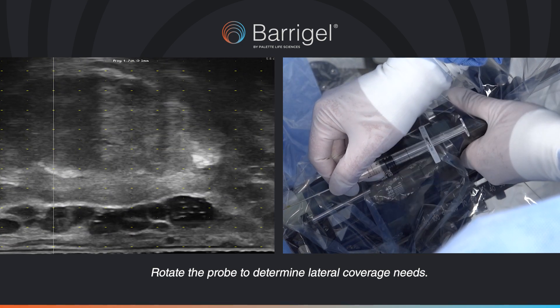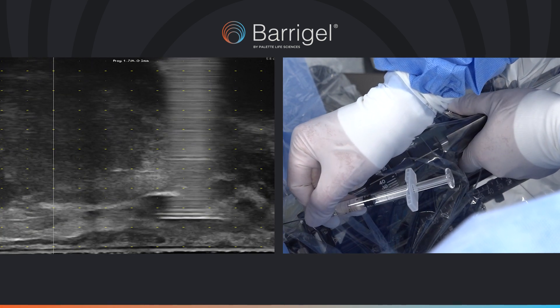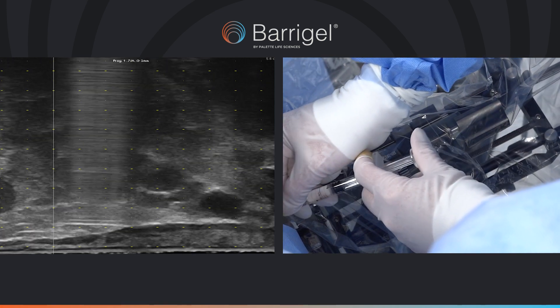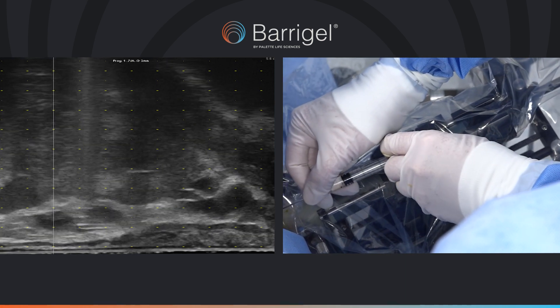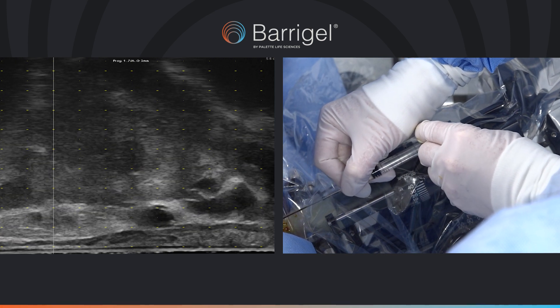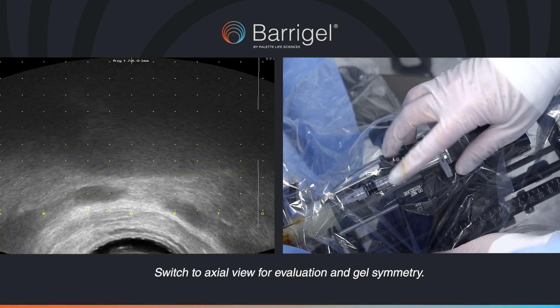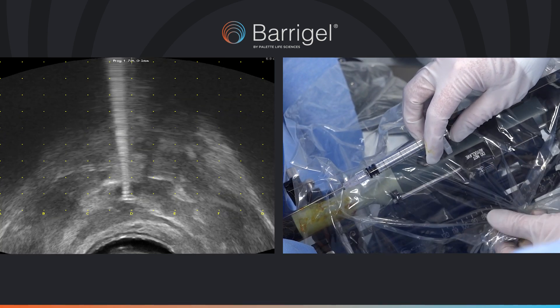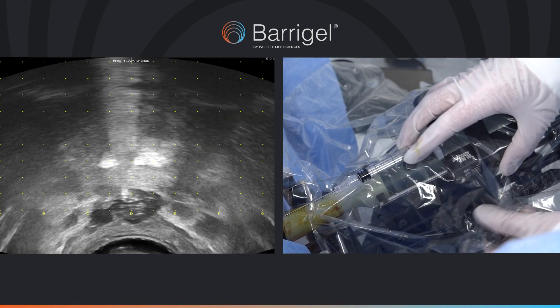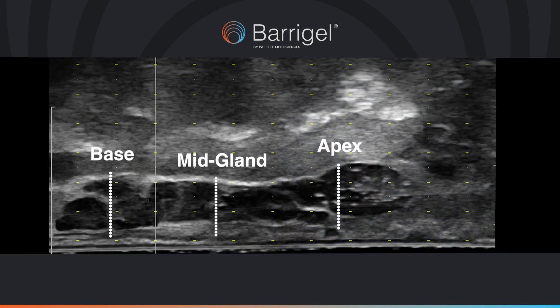Rotate the probe to determine lateral coverage needs. Switch to axial view for evaluation and gel symmetry. Notice the consistent spacing from base to apex.